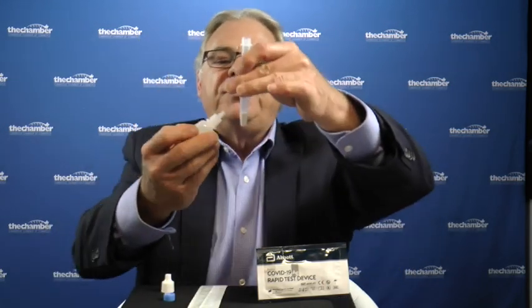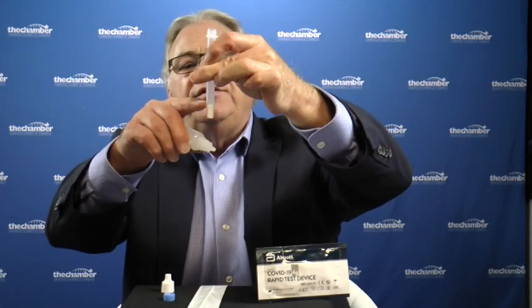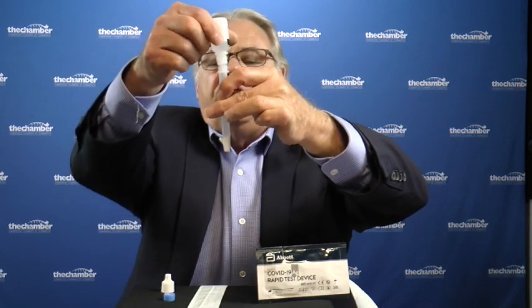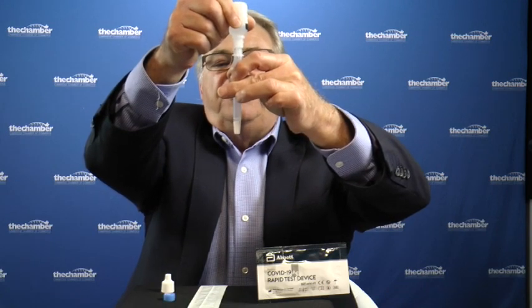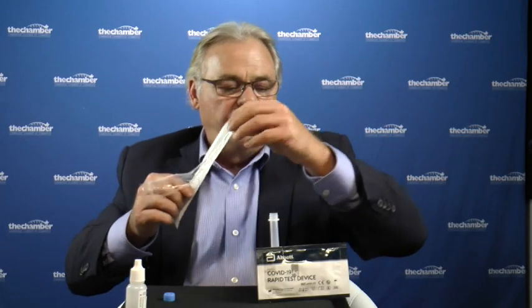You first take the vial, and you make sure you load it with buffering agent first. It's very, very simple. You'll see a little line on the plastic vial. This is very squeezable and pliable. It's a little line down there. You only put enough buffering agent to come to the line, just to the line, not over it and not under it. Right at it. Once you have the buffering agent loaded into the vial, you will have your employee open up their swab.